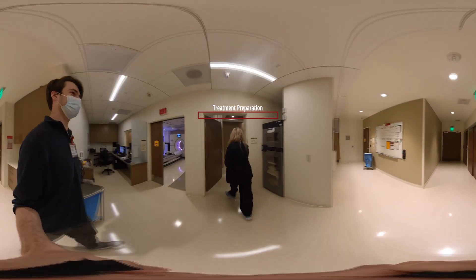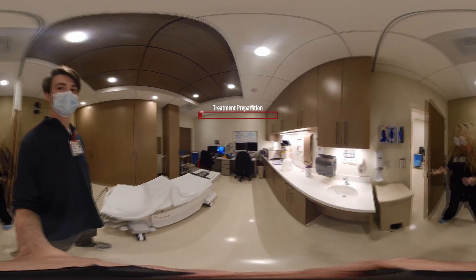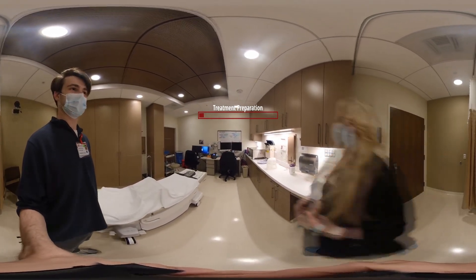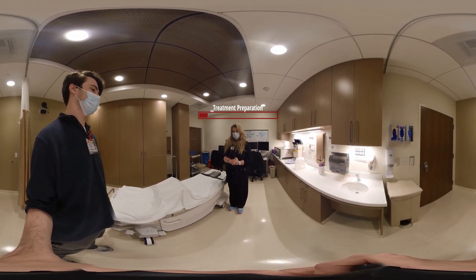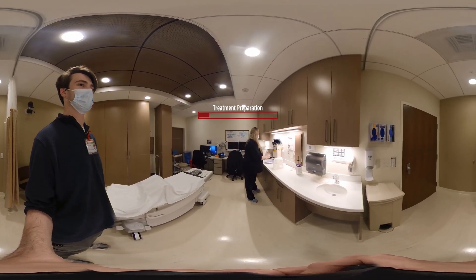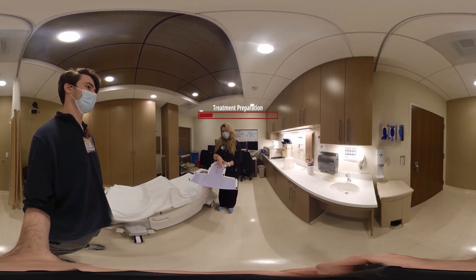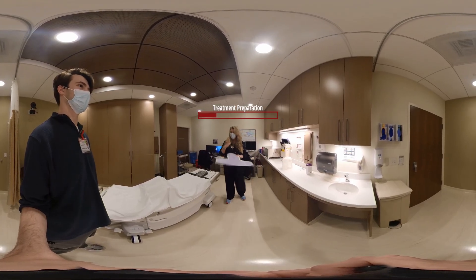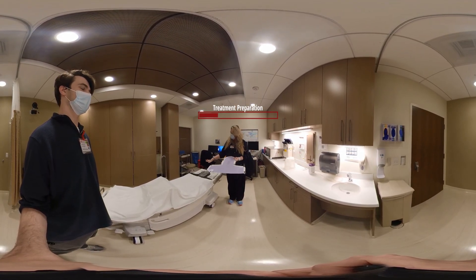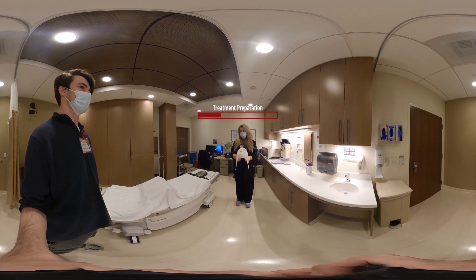Hi, my name is Nicole. I'm the radiation therapist. Come on in. This is our treatment prep area. We're going to be making a mask today in preparation for your simulation. We're going to have you lie down here. We're going to be making a custom mask. All that consists of is this material, which is a plastic thermal material that we put in hot water in our water bath right here. It makes it like a nice warm, almost hot washcloth. We place it over your face and it cools quickly, forms to your face, and holds you into the treatment position.